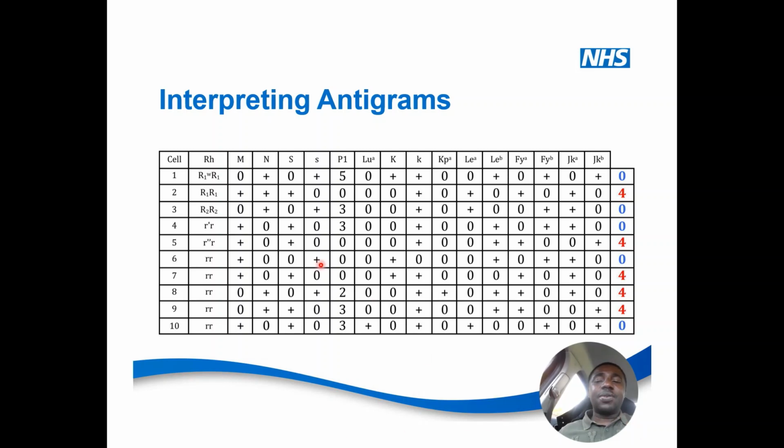Let's look at this example. So this is an example of the antibody. Okay, so this is a panel sheet. These are your panel sheets, and these are the results here. If you look at this result, these are the results you've done. This is your IAT. I've already told you in my previous video that what you need to do is match the pattern of what is here, either this way or that way, and so on.